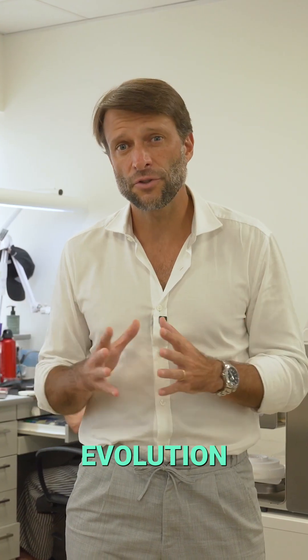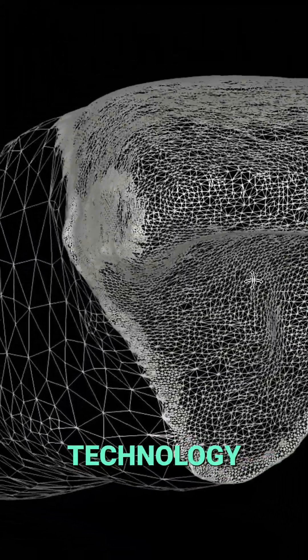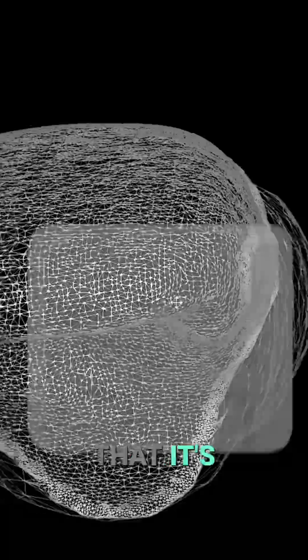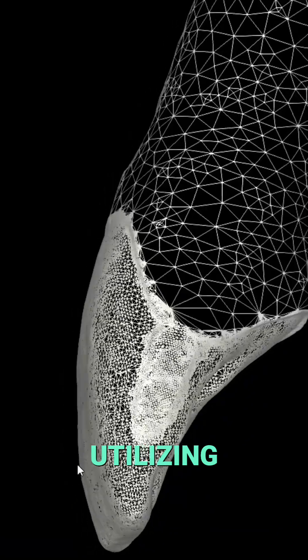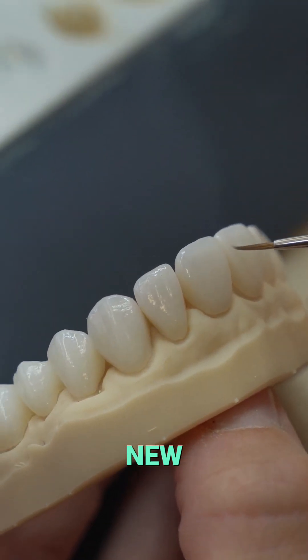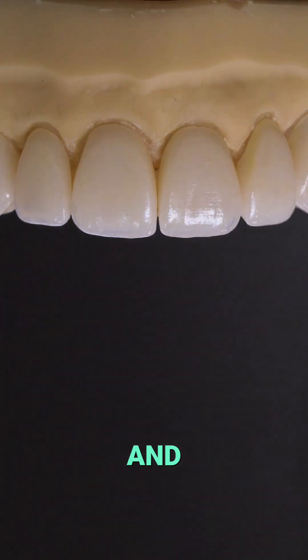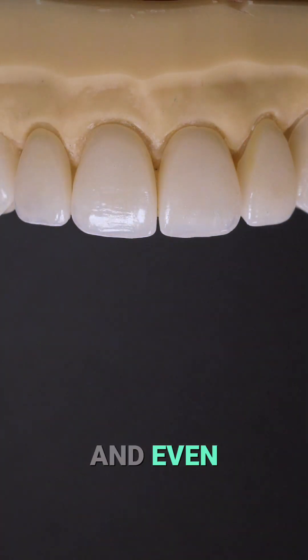But with all the evolution that happened in technology and in scanning technology, we decided that it's time for DSD Natural Libraries 2.0, utilizing the best scanning technology to scan new natural dentitions and create a new library with even better morphology and even better texture.